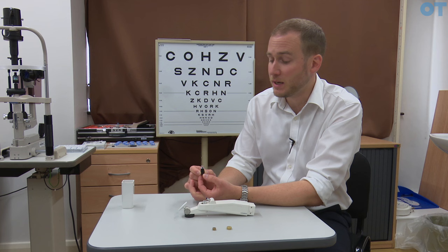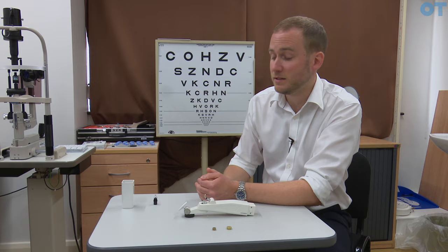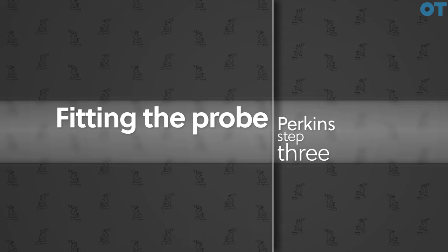In practice we would be calibrating the instrument on a daily basis. I would keep one probe to the side that I only ever use for calibration, which is never used on a patient. When I see my first patient I would have a clean probe accordingly.